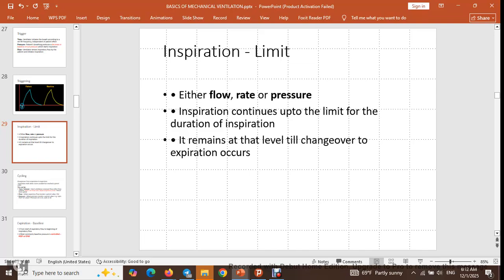But during assisted control, the patient assists the mechanical ventilator. The inspiratory trigger can be based on the pressure, and volume control is different. In pressure assisted control, it can be pressure trigger; in volume assisted control, it can be flow trigger.